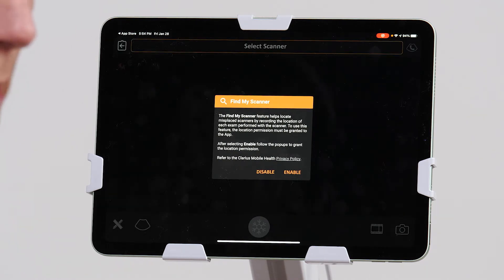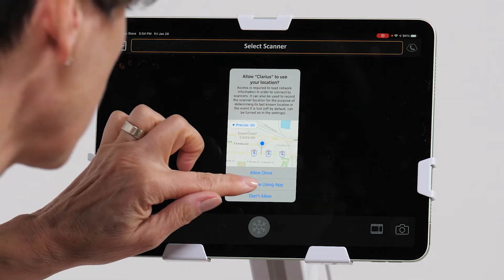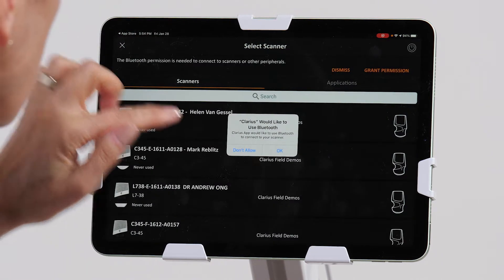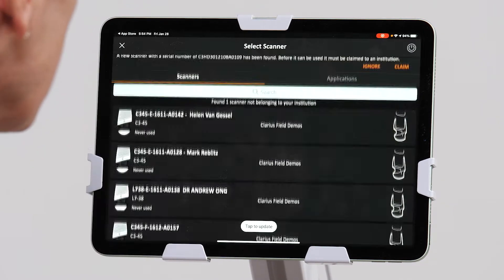And now I'm going to enable my scanner, and this is asking me to use location services. I do want to allow this while I'm using the app because we want to be able to track where our scanner was last used. It's also asking me if I want to allow Bluetooth location, and we're going to say yes.